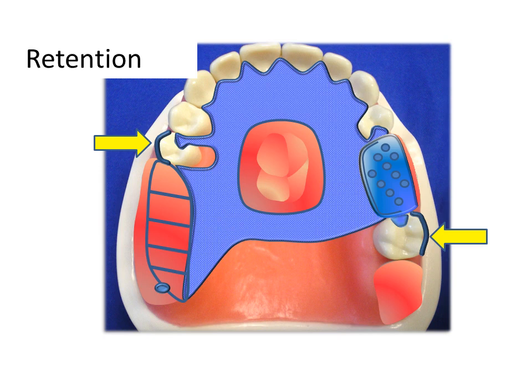But do recall, Marie, that we have recontoured the axial surface to ensure that the rigid portion of the clasp lives in the middle 1/3. Quite so, Dr. Goon, a factor all too often overlooked by the novice. Now Dr. Goon, the clasp on number 12 requires special consideration. Indeed it does, Marie. You see, the entire tooth is anterior to the fulcrum line.